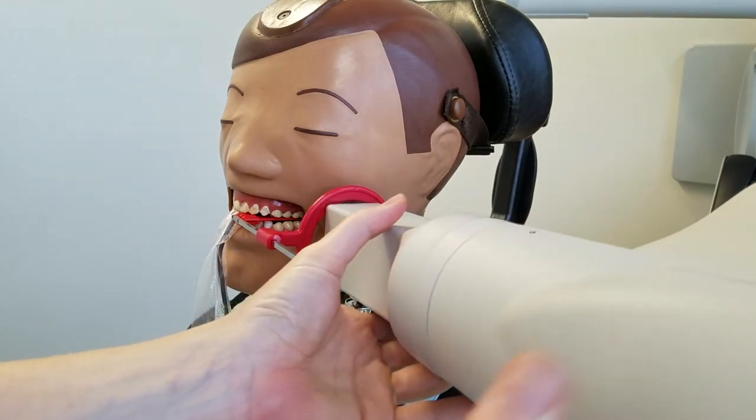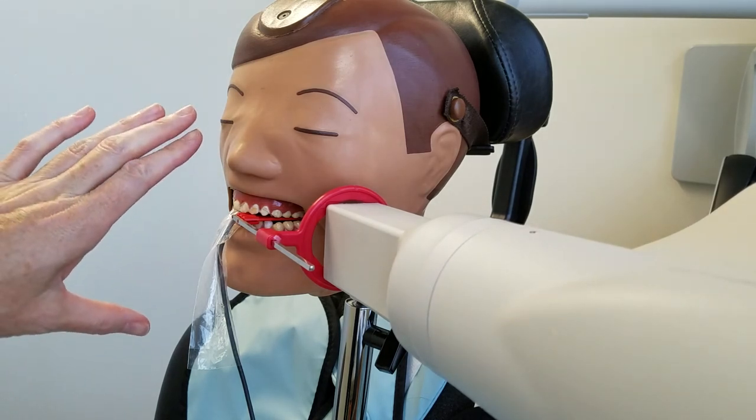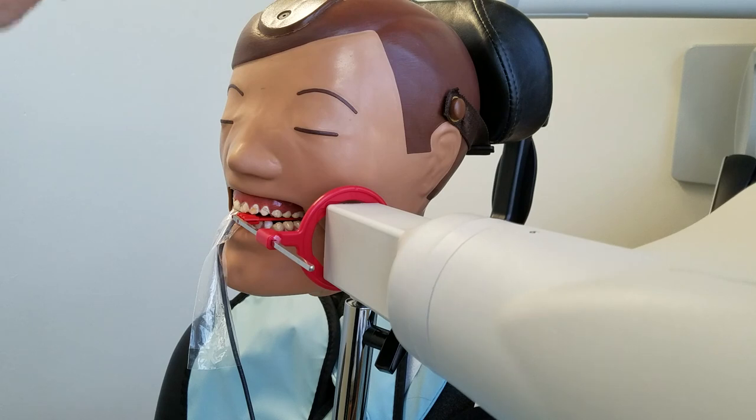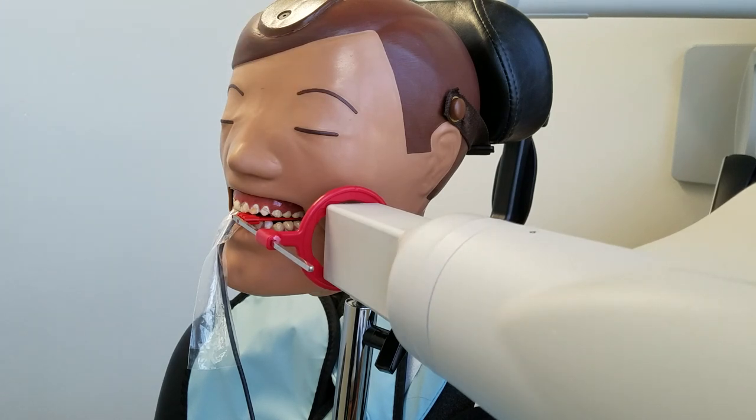I'll show you a little bit closer on a typodont with the placement, but that's the main difference with the vertical — our sensor goes up and down instead of horizontal. And we may end up needing to take three films in a bite wing series when doing vertical, as opposed to two, depending on the patient's mouth.